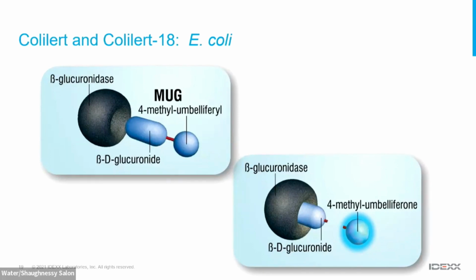In this case, it's 4-methylumbelliferyl beta-D-glucuronide, which I have to say, after 21 years of working at IDEXX, I finally get used to saying this without having to read it letter for letter. But again, we like our acronyms, and this acronym is MUG. So again, keep it easy.